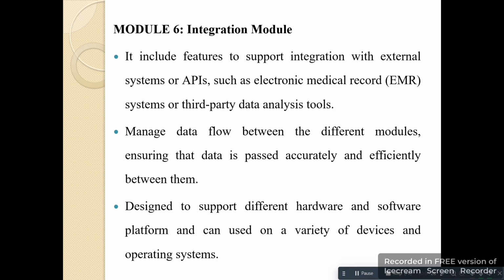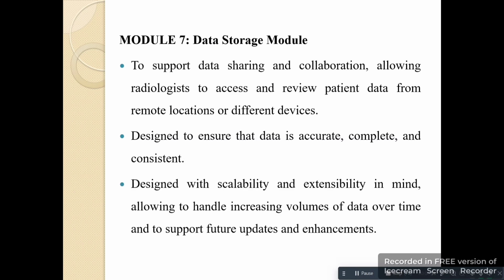Integration module 6. It includes features to support integrations with external systems or APIs such as electronic medical record, EMR, systems or third-party data analysis tools. Manages data flow between the different modules, ensuring that data is passed accurately and efficiently between them. Designed to support different hardware and software platforms and can be used on a variety of devices and operating systems.